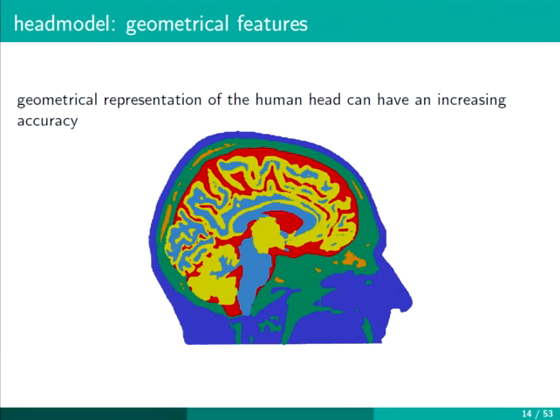And for the white matter, we can use DTI data, so relate the diffusion tensor to the conductivity tensor. So somehow it is individualized, I would say. But anisotropy, we wouldn't use anisotropy for the whole head, for sure, because then the computational cost will also explode. The anisotropy part, no, not so far.